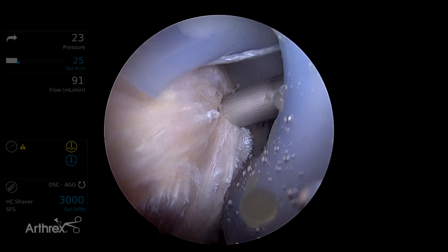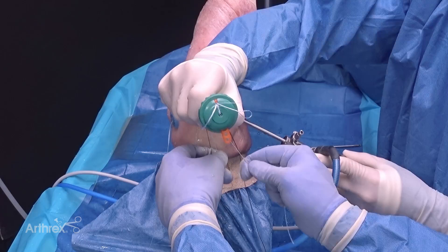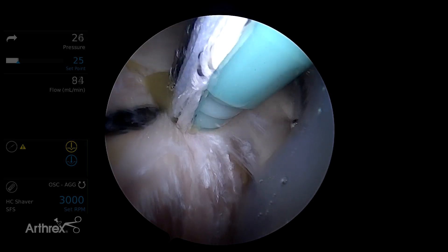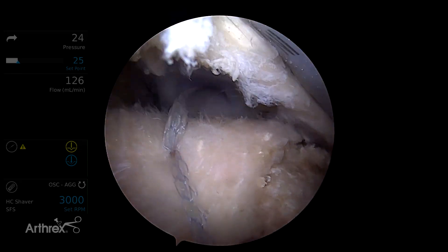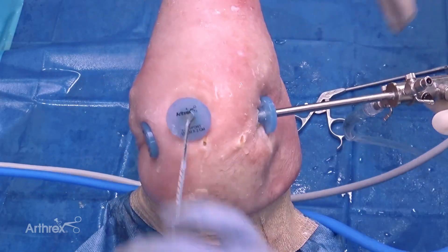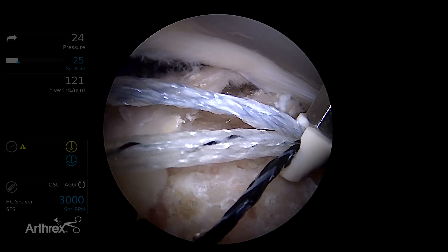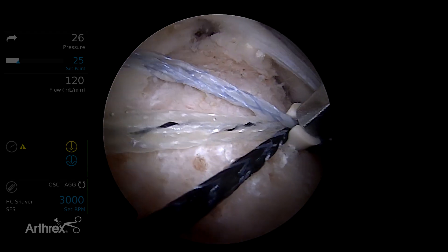We're first going to place our posterolateral anchor. We'll insert the punch to the laser line. The sutures are loaded through the eyelet of the swivel lock, and while hovering the eyelet above the socket we'll remove all slack from the construct, then insert the anchor. We use a fiber tape cutter to cut the sutures adjacent to the anchor. Now we're going to retrieve all the remaining limbs out the lateral cannula and place the anterolateral anchor. We'll punch to create our socket. Again all three tapes are passed through the eyelet of the knotless swivel lock, and with the eyelet above the socket we remove the slack from the fiber tapes. Once the slack is removed we insert the anterolateral anchor.